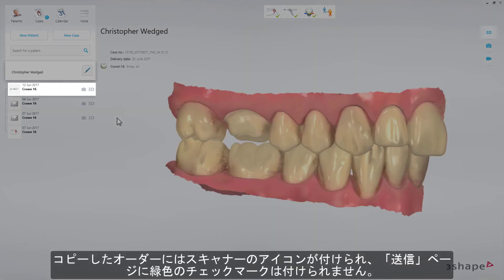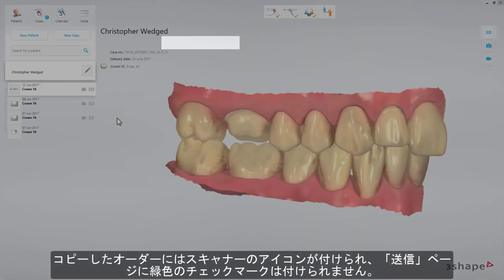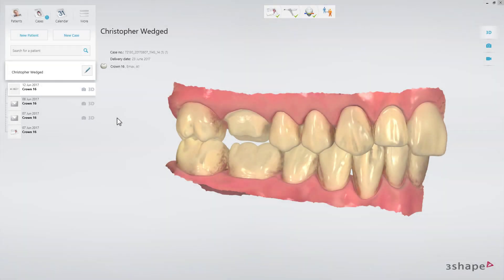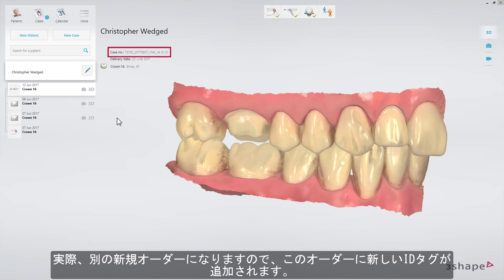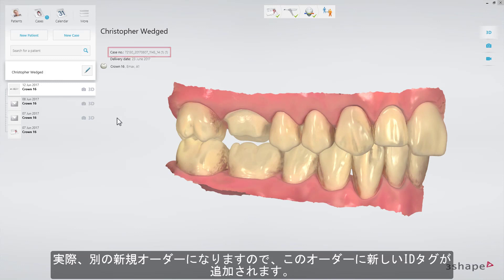The copied order will now have a scanner icon and the send page is not marked with a green check mark. Also, the order has a new ID as it is in fact a new separate order.